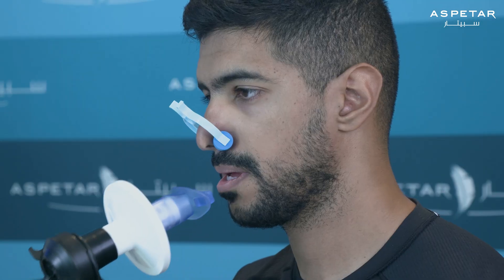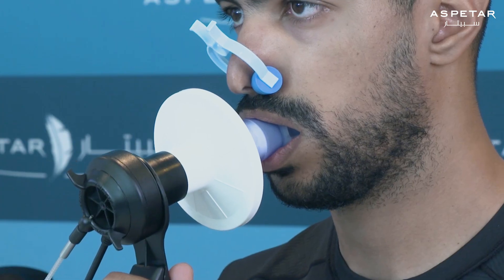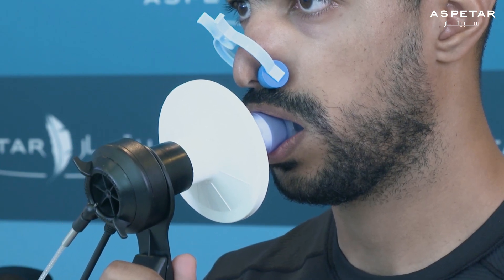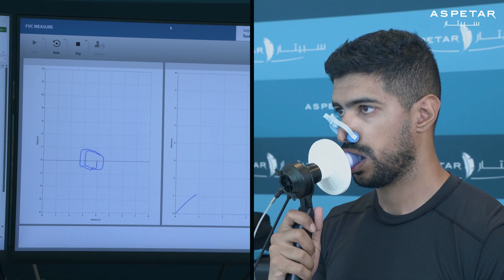To perform the forced vital capacity, you will wear a nose clip and insert a mouthpiece connected to a metabolic cart into your mouth. The mouthpiece must have a proper seal so that air does not escape. Once the mouthpiece is inserted, you will take three to five breaths as normal.